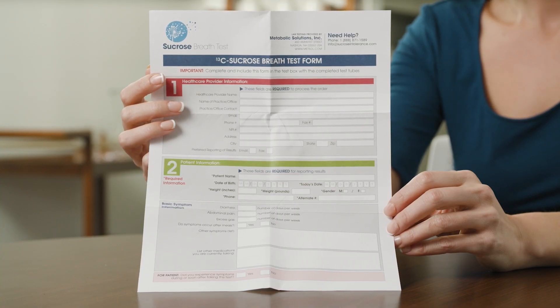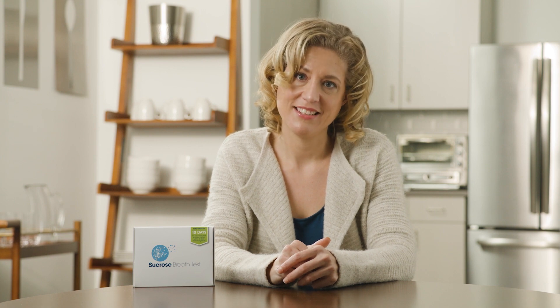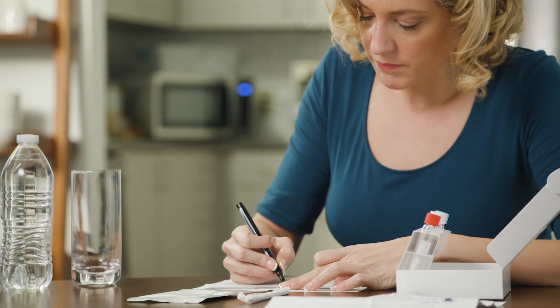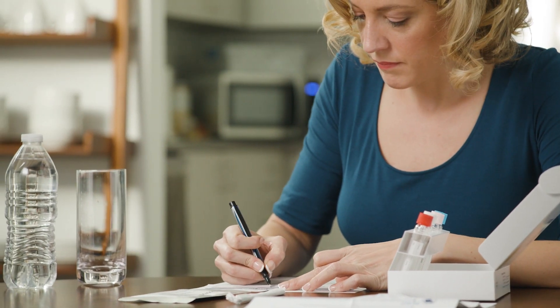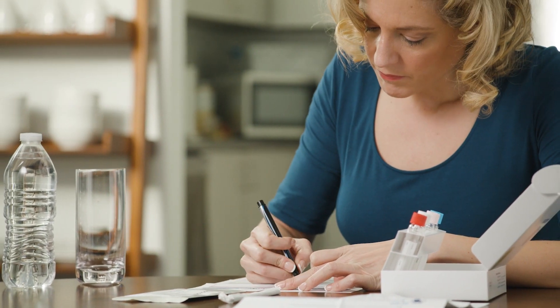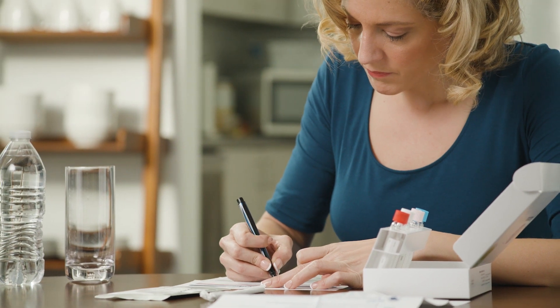Please be sure to place a completed test form back into the test kit before sending. After you have completed the 8 hour fast, you are ready to begin performing your test. First, retrieve the test form from the kit and complete all required fields. If your health care provider did not complete part 1 of the form, please call your provider's office for that information.